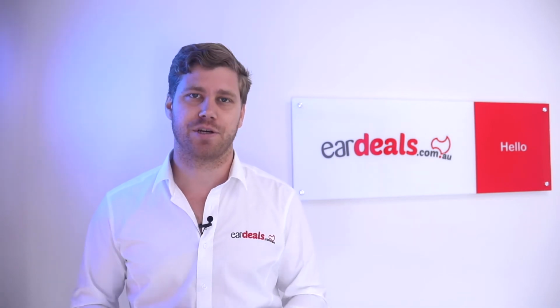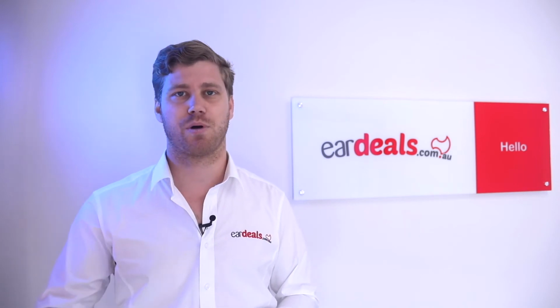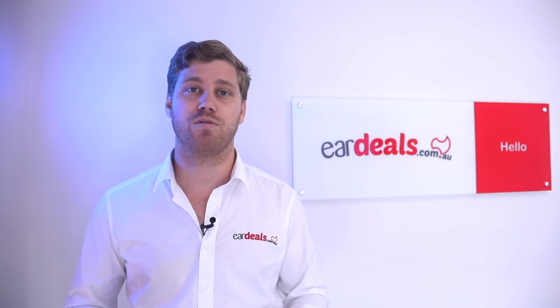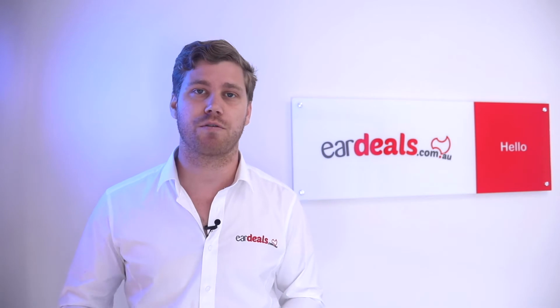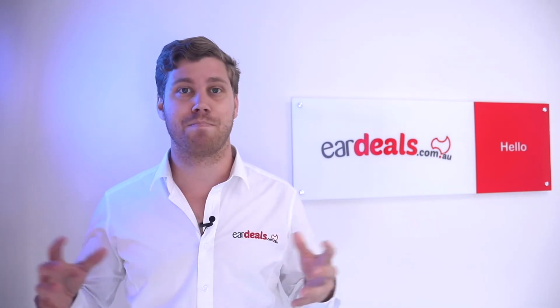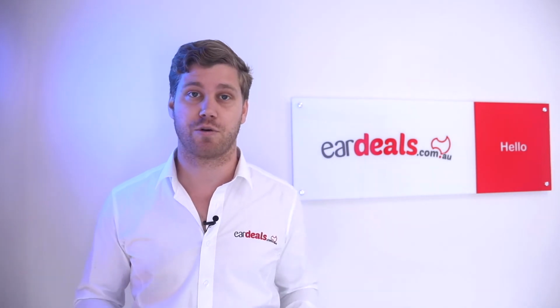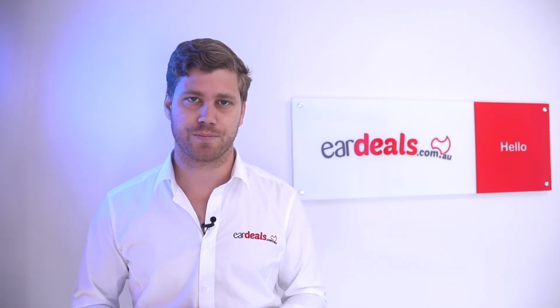We'll start with budget. As you go higher in technology level, you are increasing the price of the hearing aid. And this is because the hearing aid software improves in the sense that you get added capabilities for things like directionality of the microphones to localize in on voices, better automatic capabilities of picking up voices as they transition around you, and enhanced listening experience, to name a few.